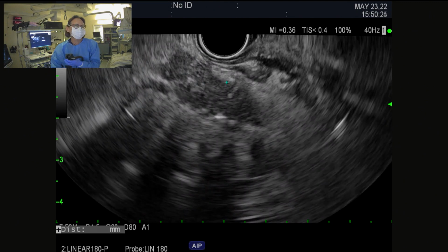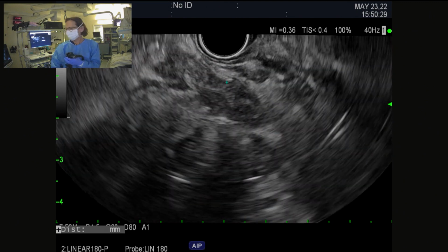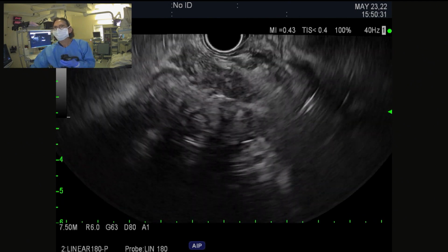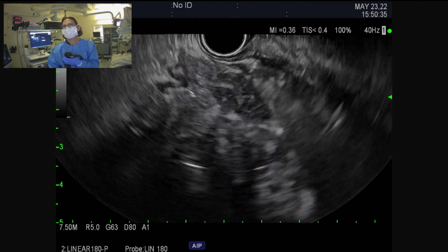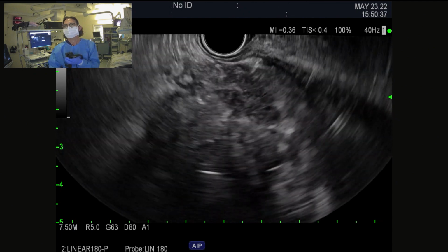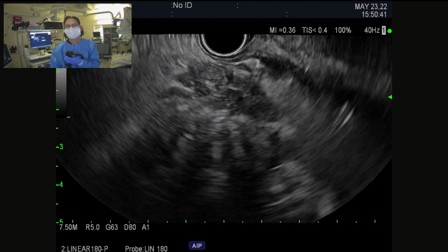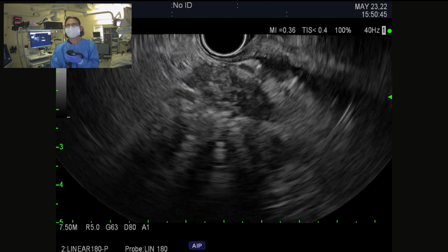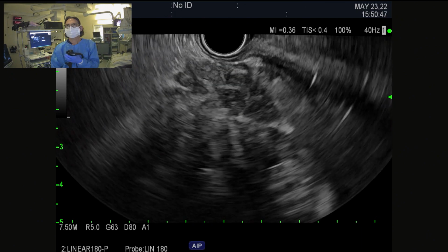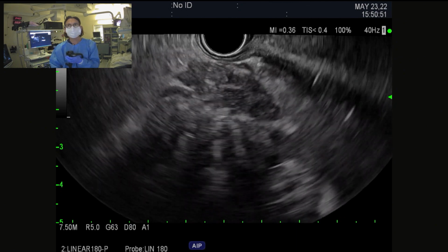Yeah, so Ken, we see this after percutaneous drainage because through the drain, the fluid comes out and you're left with the solid. And so what I would do under fluoroscopy is just inject some fluid. You see the EUS scope in proximity to the perc drain, you know it's there, and filling it with some fluid makes your job much easier. That's true, Muen. That's a great suggestion.